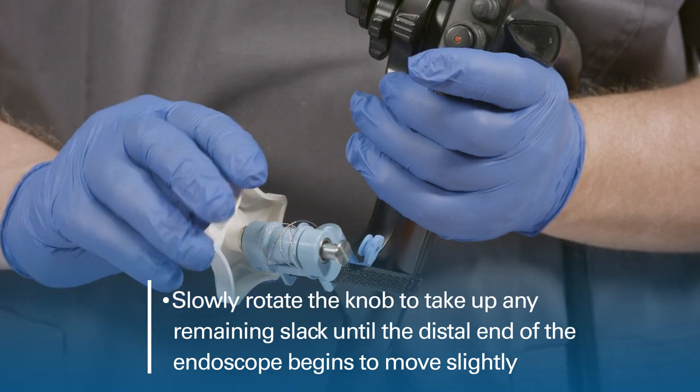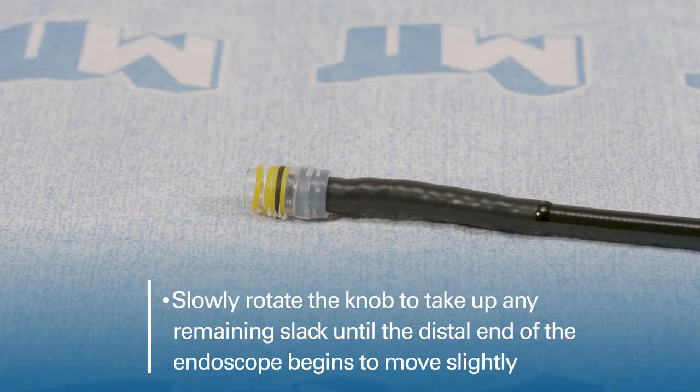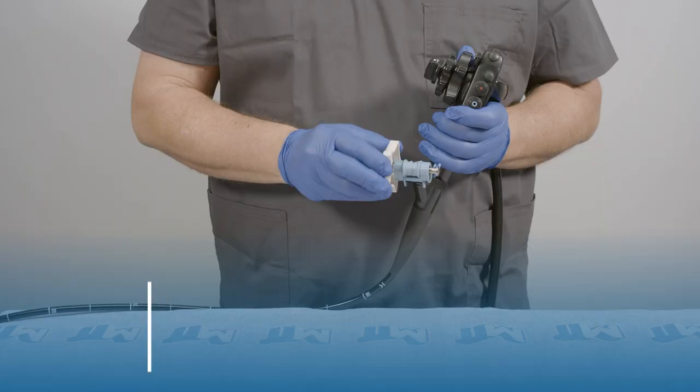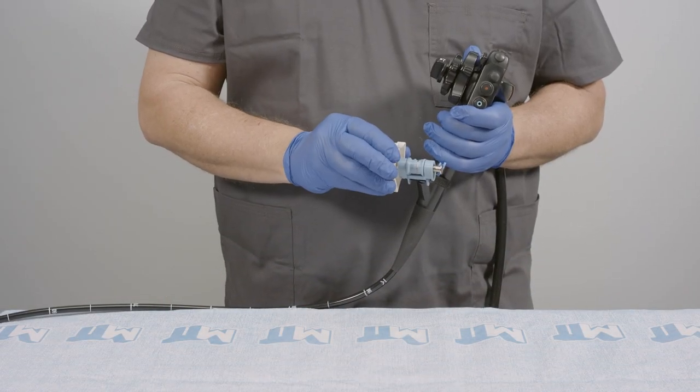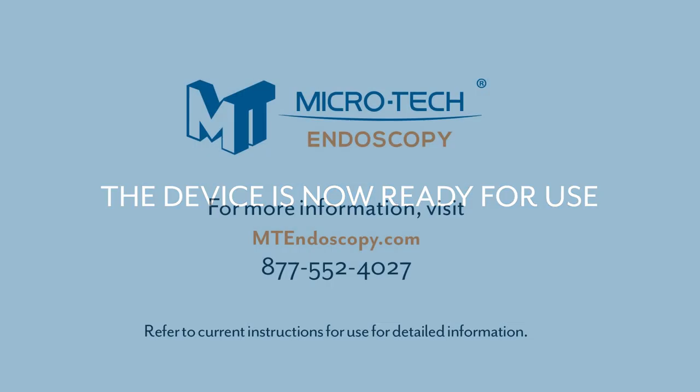Slowly rotate the knob to take up any remaining slack until the distal end of the endoscope begins to move slightly. This indicates that all the slack has been removed and the device is now ready for use.